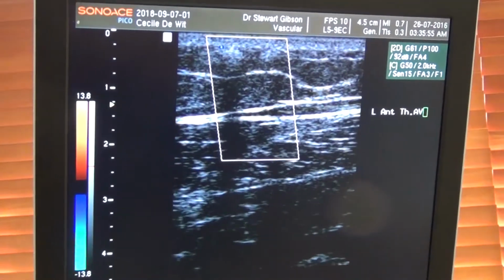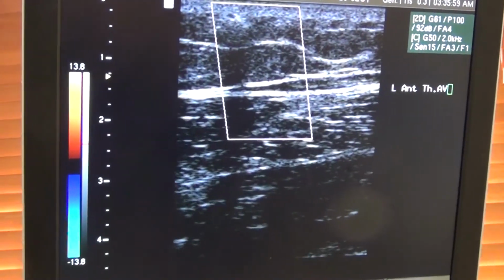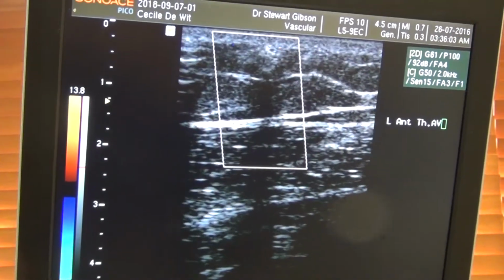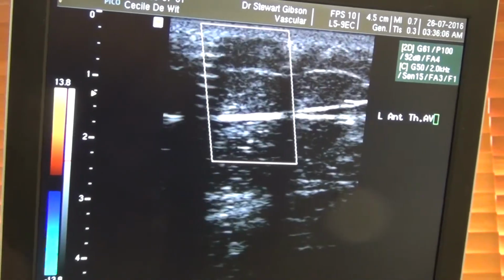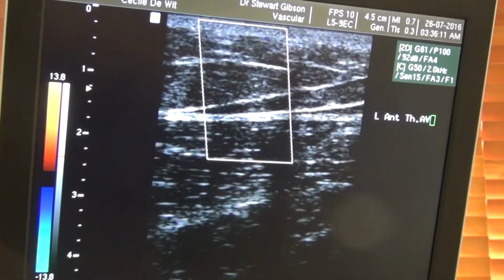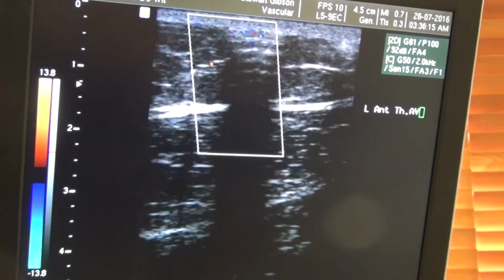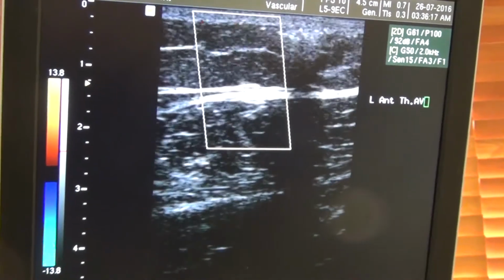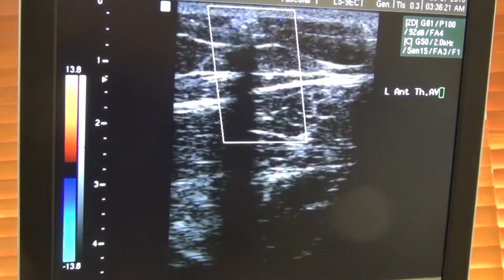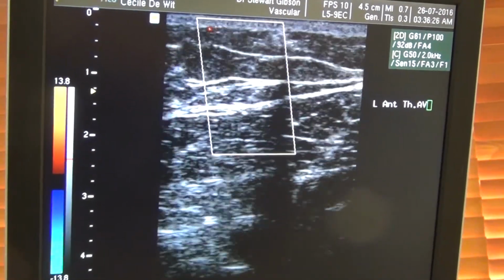Post-endovascular ablation, we look at the same area where we had the arteriovenous anomaly, and we see that there's no further flow. We can see the starry night picture of residual foam and gas bubbles from the laser in the ablated blood vessel, following it down into the anterior aspect of the thigh, and we see no evidence of any arteriole.